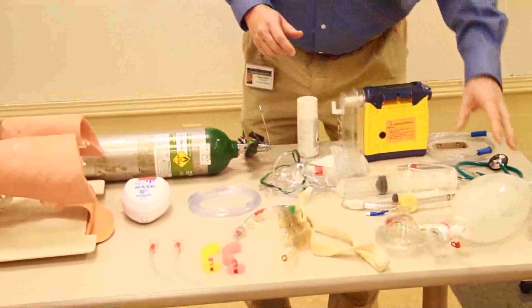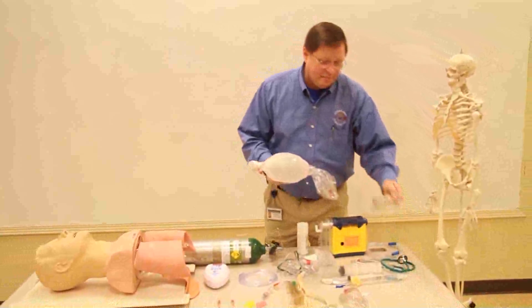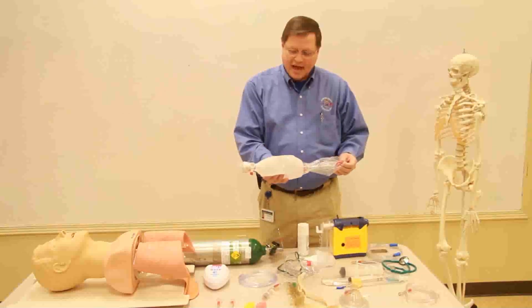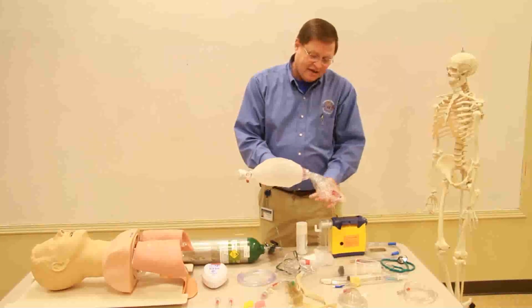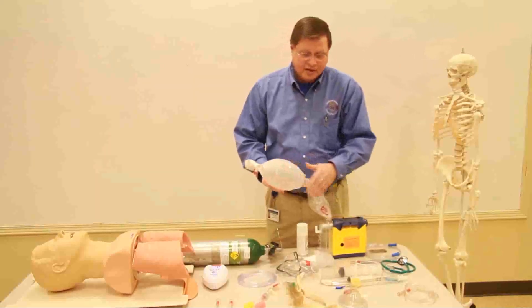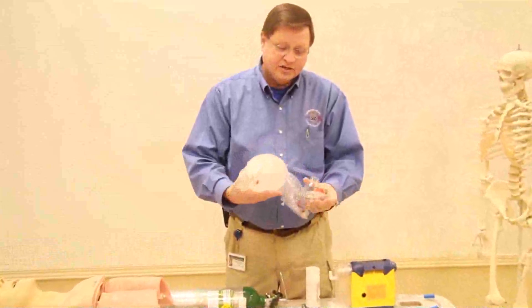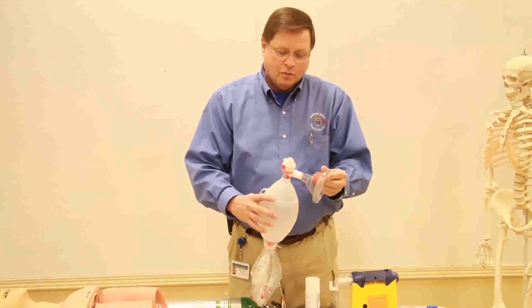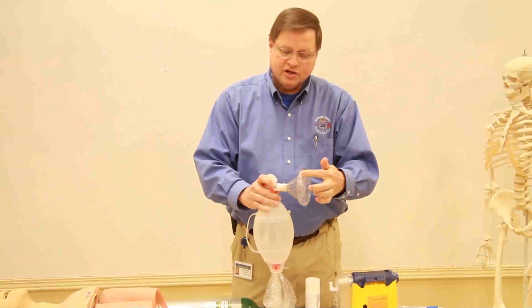The bag valve mask device is a self-expanding bag. It has the capability of being hooked up to oxygen. This reservoir needs to be continually filled so that when we squeeze the bag — it has a one-way valve on each side — the oxygen will be taken from this reservoir bag and fill this bag so we get near 100% oxygenation. The mask has to be clear at the top so you can see any vomitus, and it has to be very pliable. We put these together very quickly and easily, and this will actually rotate so you can go left or right side.